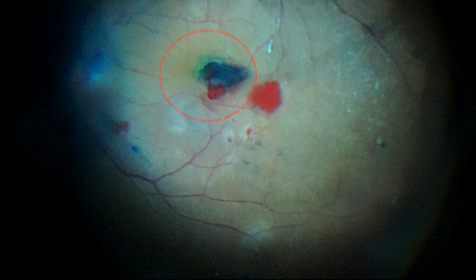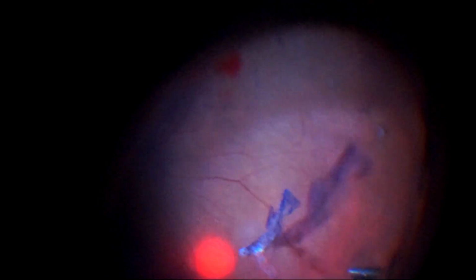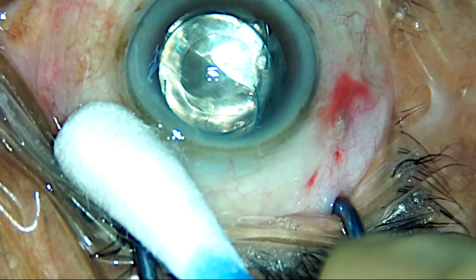An area of inadvertent touch to the retina, which was noted, is lasered. Fluid air exchange is performed again before softly tucking in the free flap one last time into the macular hole. A clot noted near the flap is removed with the Softip cannula. C3F8 gas is then used for tamponade and the ports are closed, and thus we are able to overcome all the challenges that we have faced during the course of this surgery.